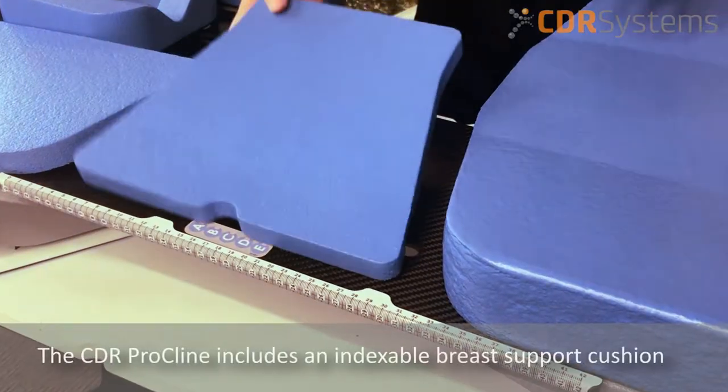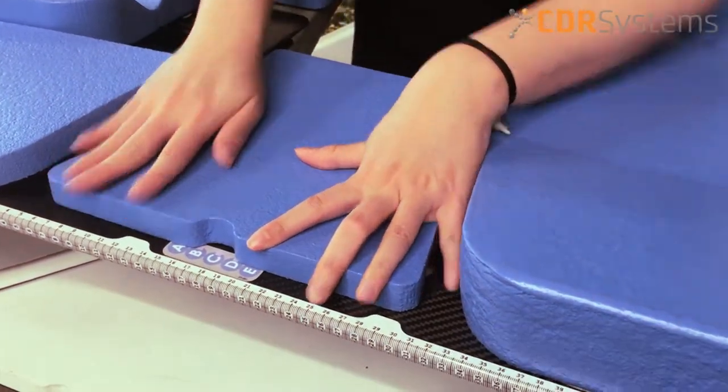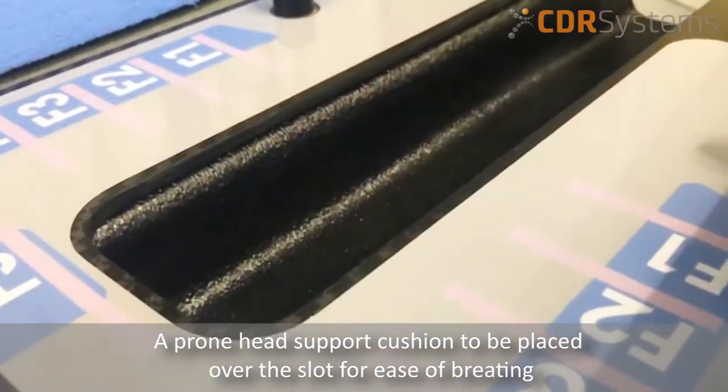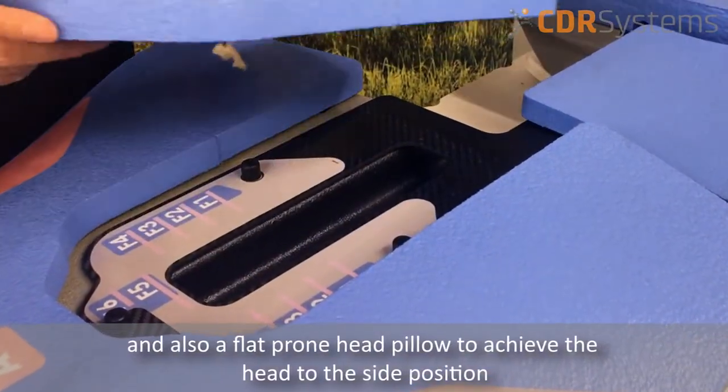The CDR Procline also includes an indexable contralateral breast support cushion, a prone head support to be placed over the slot for easy breathing, and also a flat prone head pillow to achieve the head to the side position.